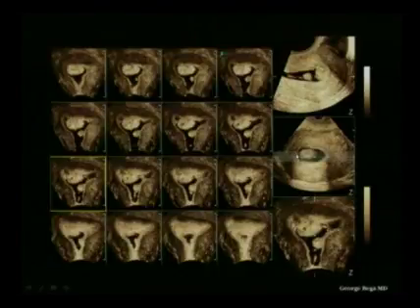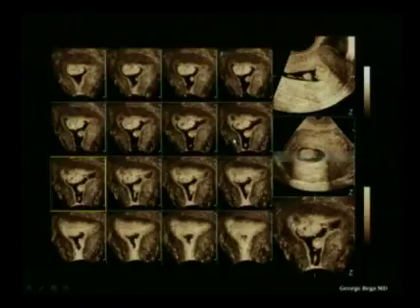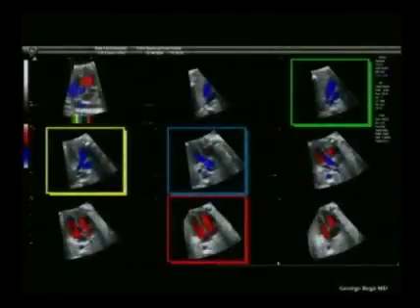The distance is also operator selectable. You can either fan this grid into a coronal, or you can have it in a sagittal, or you can have it in a transverse, and interactively obtain every single image plane displayed as such. You can have a number of them. You can have only 3, 4. You don't necessarily have to have 16 of them.